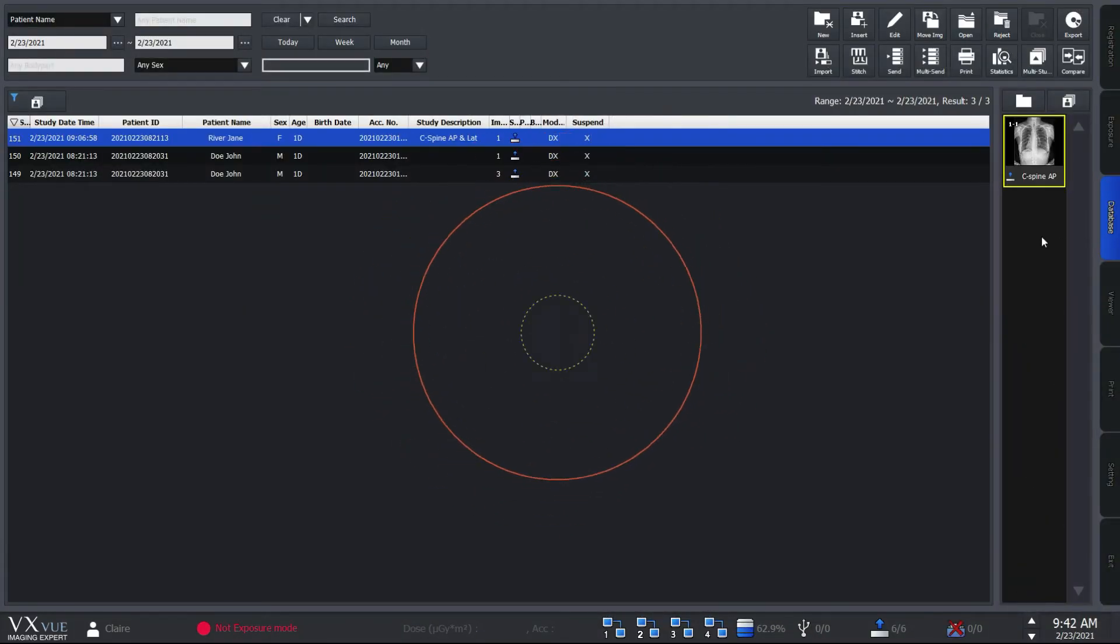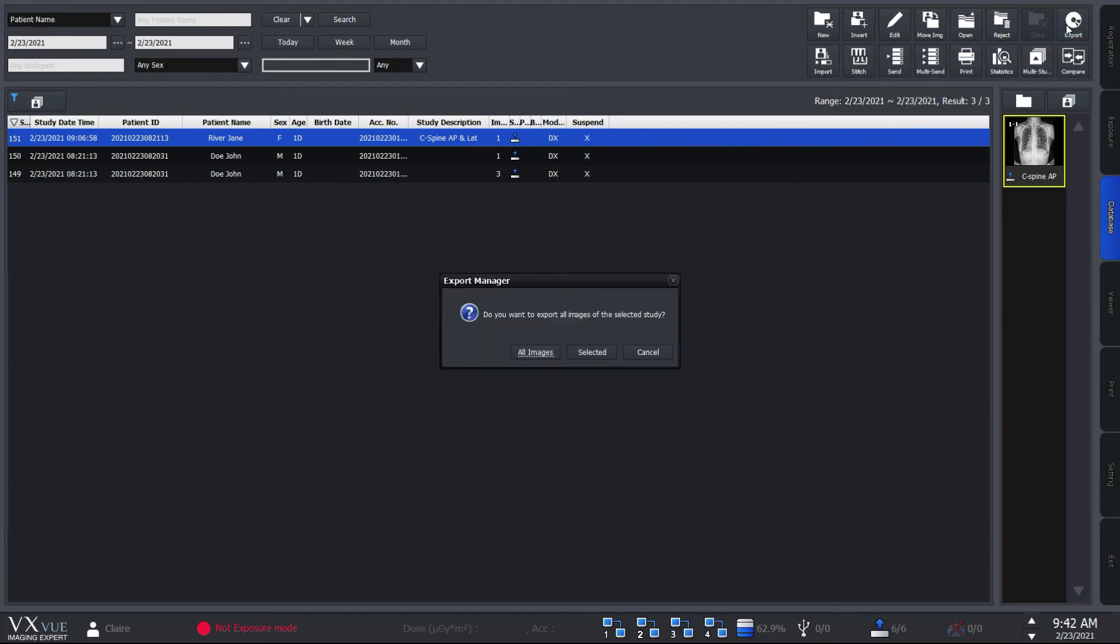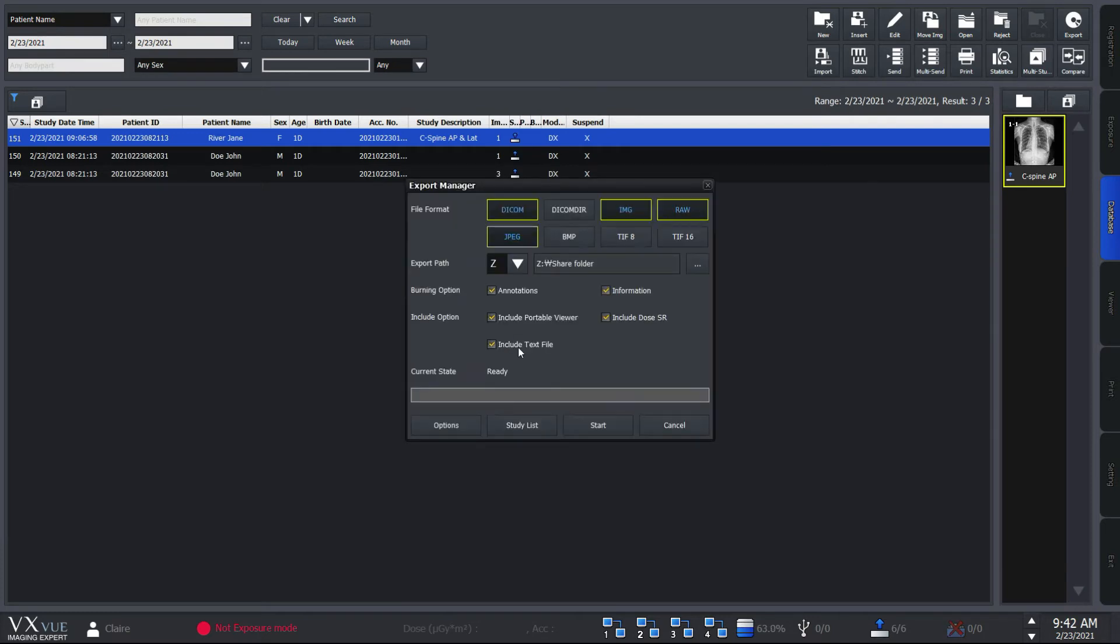When you need to export a study to another hospital, institution, or to a patient, you can use the export button here from database mode. You can choose diverse file formats from DICOM and DICOM viewer, JPEG, to raw images.